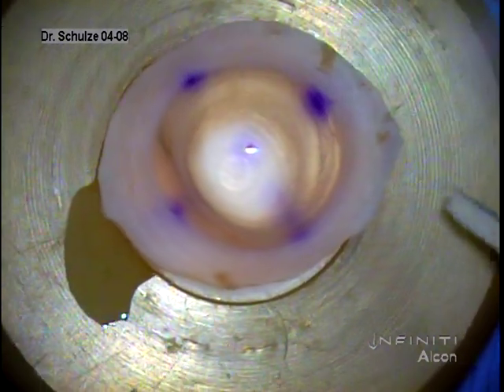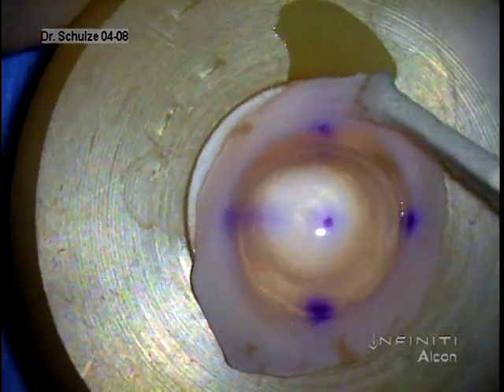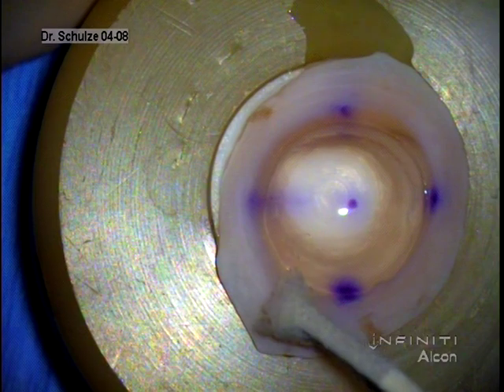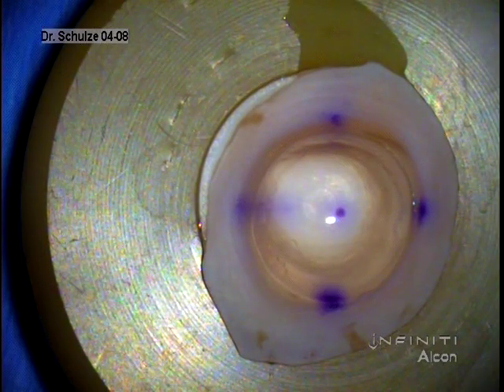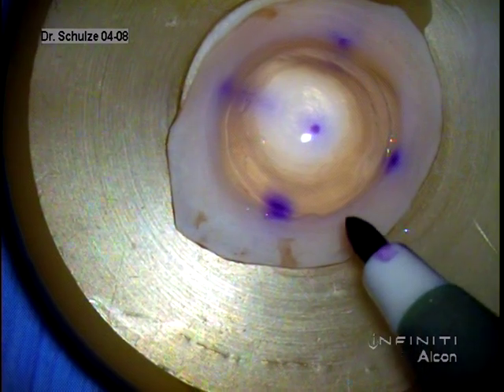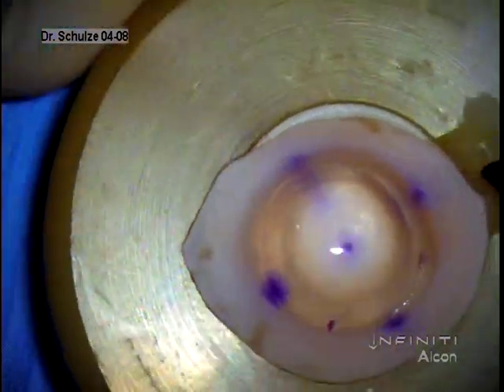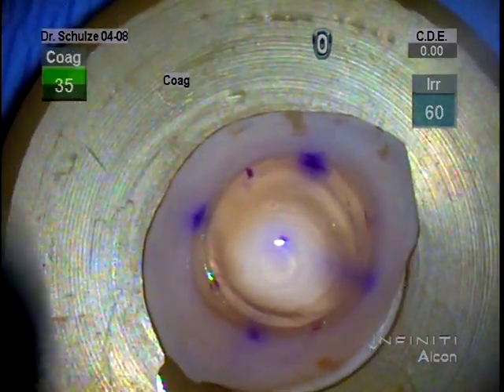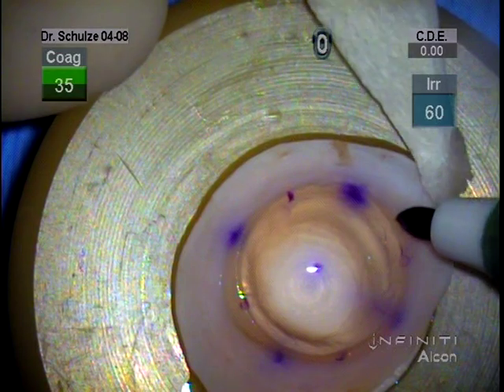Here you can see we placed the donor cornea epithelial side up on a trepanation block. I'm just drawing the margin of the bed. What I've started doing recently is marking the margin of the bed on the stromal side or epithelial side with gentian violet. So when the cornea is inverted and placed on the trepanation block, I'll have these marks to guide the centration of the trefine. I just use a manual, hand-held trefine, although you could use a vacuum punch trefine if you want.